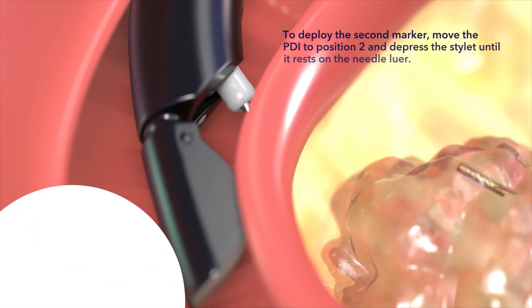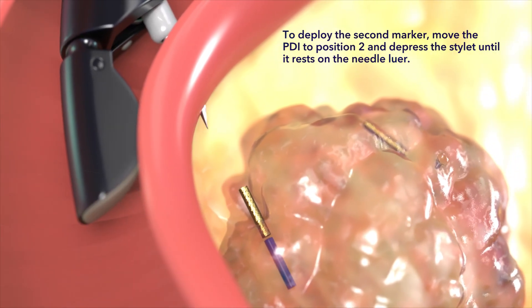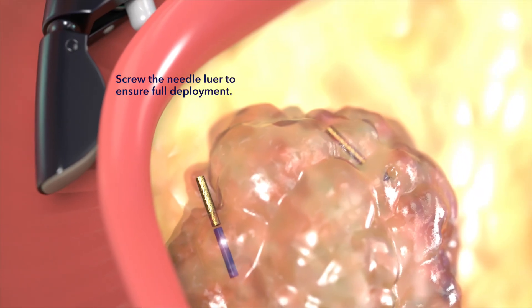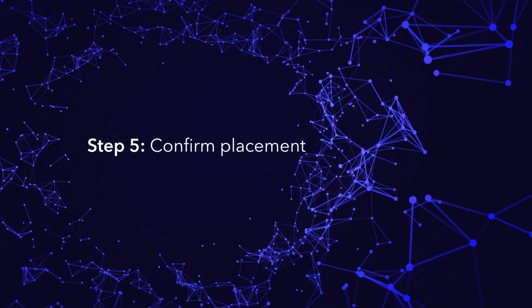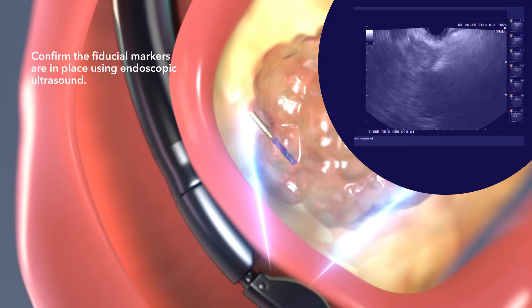To deploy the second marker, move the PDI to position 2 and depress the stylet until it rests on the needle luer. Screw the needle luer to ensure full deployment. Confirm that fiducial markers are in place using endoscopic ultrasound.